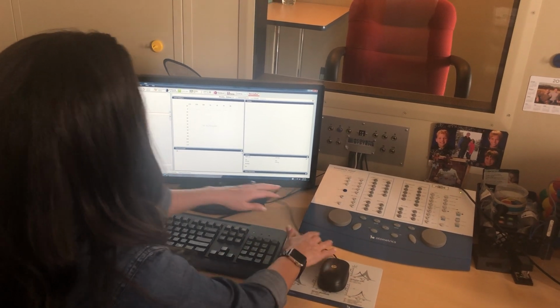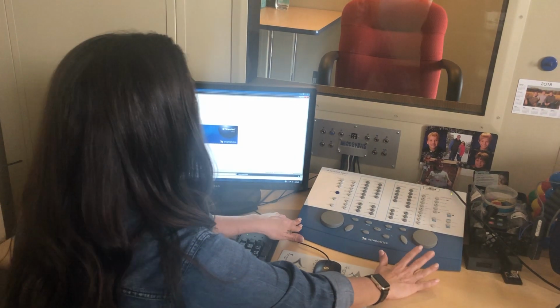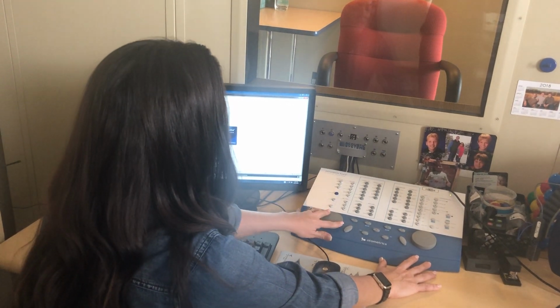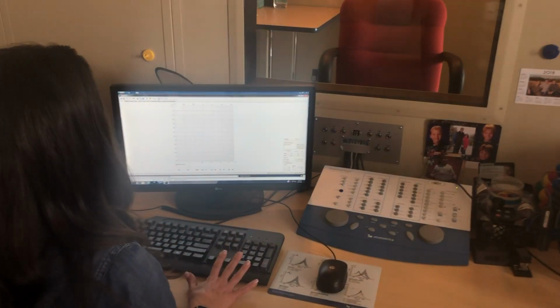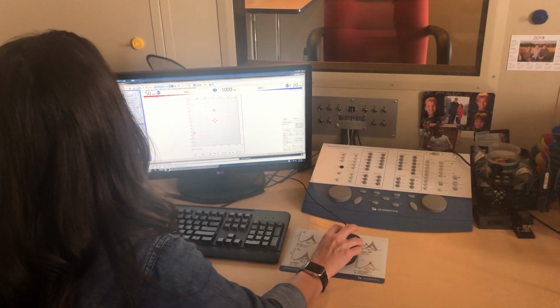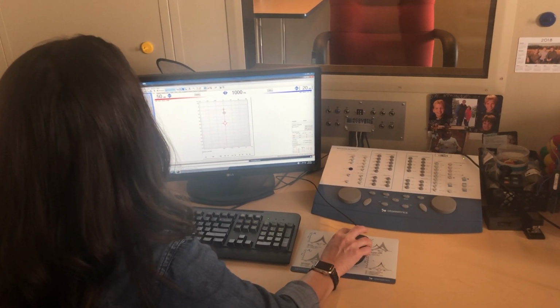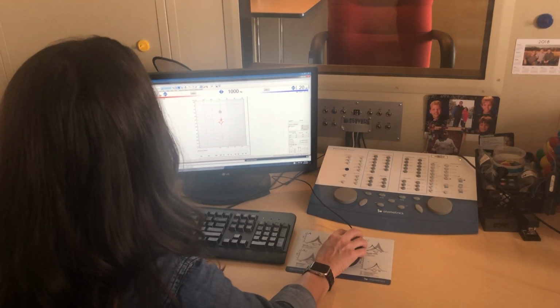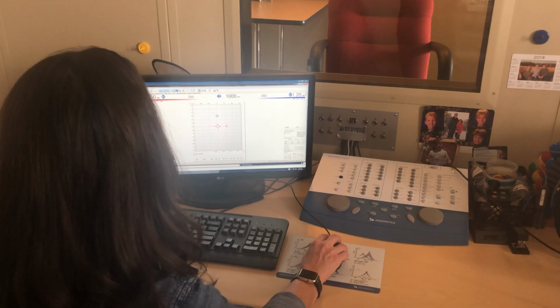So I was just discussing this with the class, but you guys get to hear it again. This is a control panel, so you actually have the option of doing the test with the control panel or using the keyboard. This is a PC-based audiometer, so it's pretty high-tech. As far as equipment goes, we have high-end technology here. We've only had this equipment for about 2 years here at Eastern.